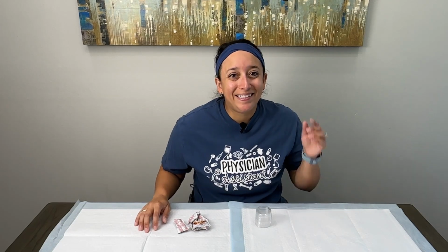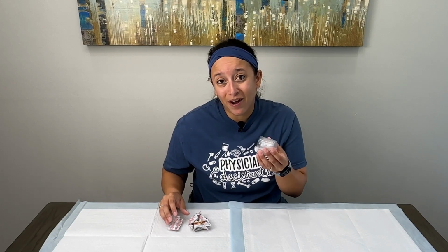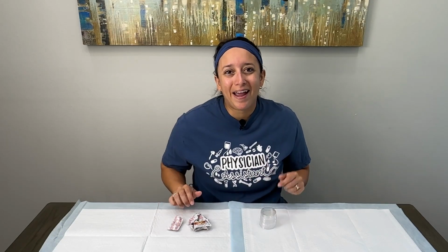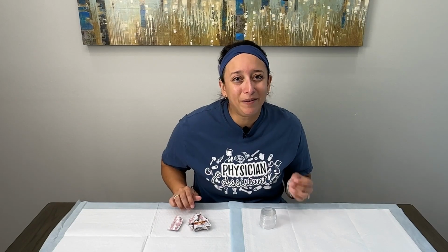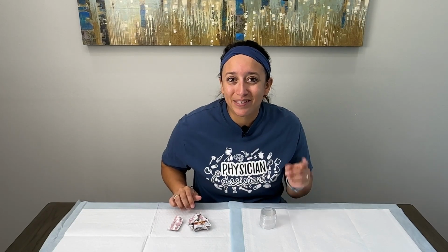Hey everyone, today I'm going to be showing you how to take some ketchup and some milk caps, put those two together, and you can make your very own nail with a subungual hematoma that you can practice draining at home. So stick with me and I'll show you how to do it yourself.